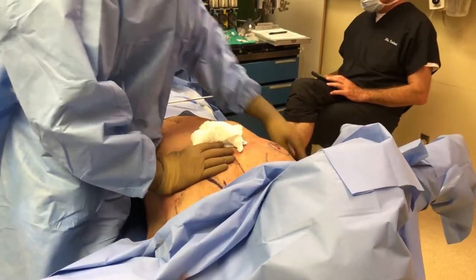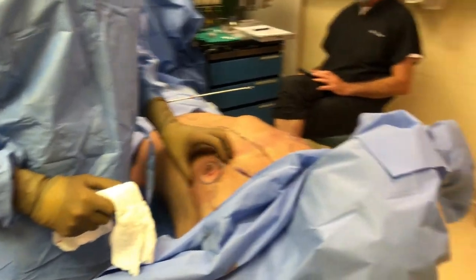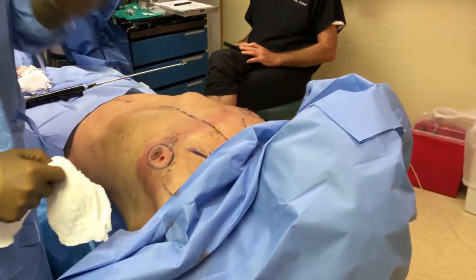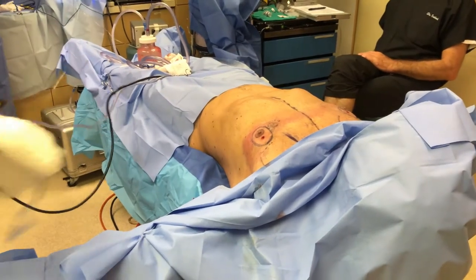Three, two, one. All right, here we have our patient. What we're going to do — we're doing our liposuction right now for excess. Then we're going to do our pectopexy. Not a mastopexy, that's for women. This is a man, we're doing a pectopexy.